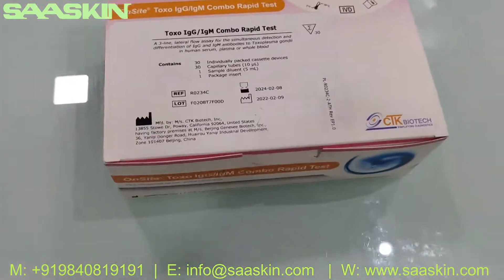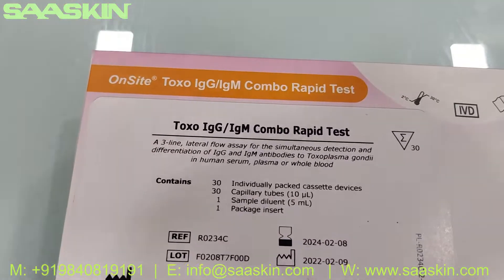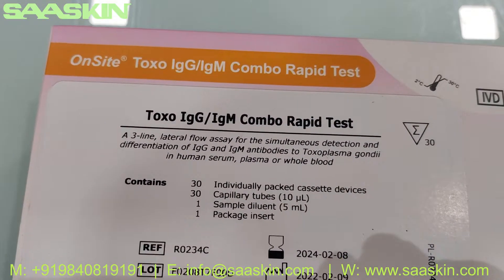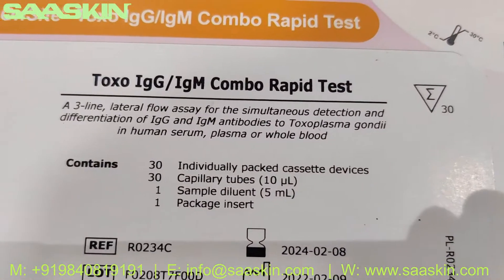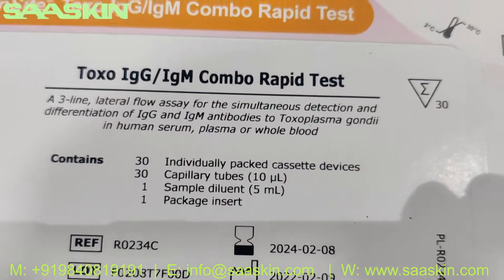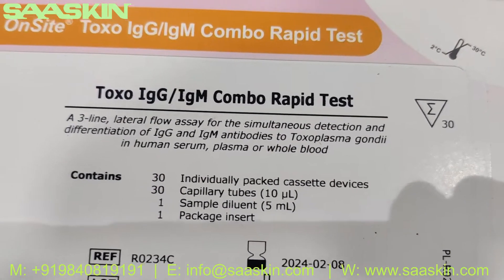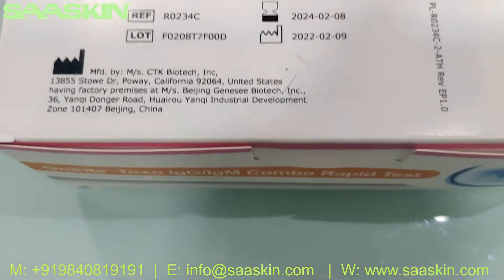Hello everybody, today we're going to see the unboxing of CTK Biotech On-Site Toxo IgG IgM Combo Rabbit Test. It is used for the detection of IgG and IgM antibodies to Toxoplasma gondii in human serum, plasma, and whole blood.